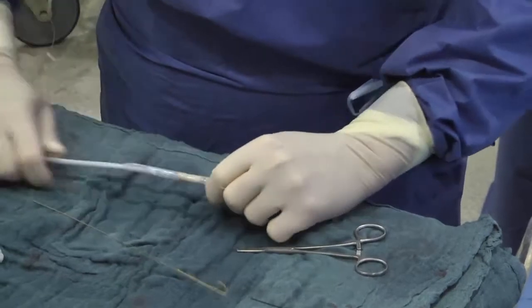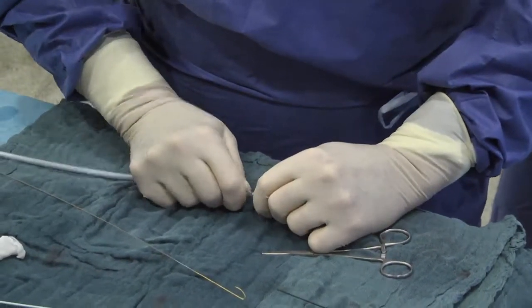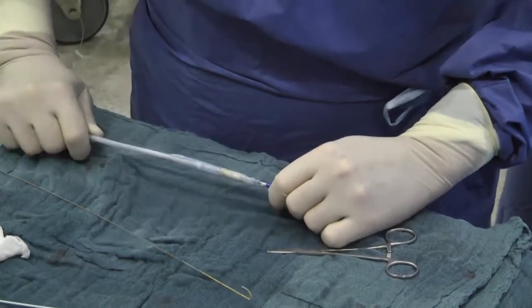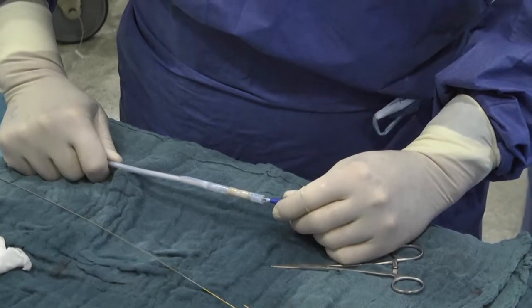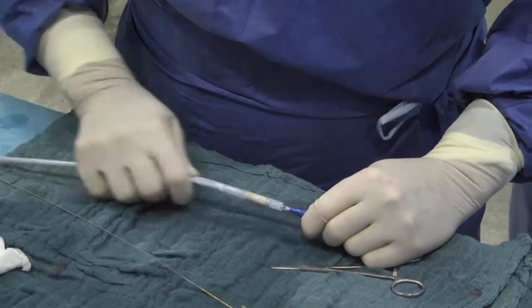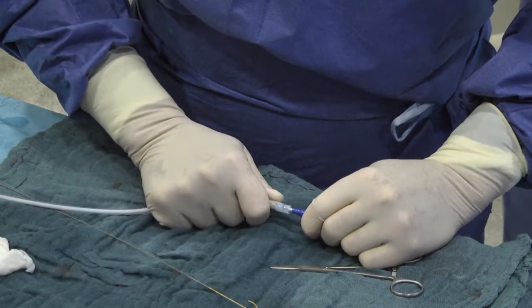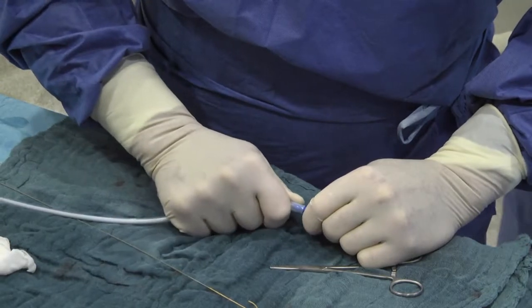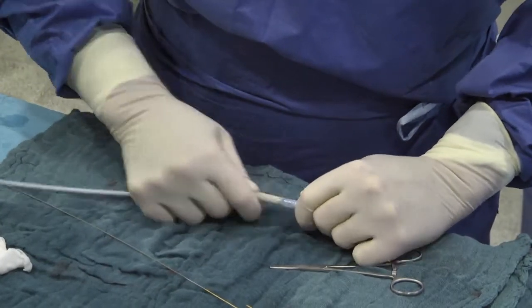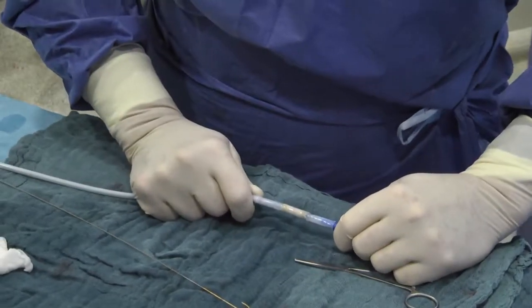Okay, there we go. This should work. Inflate the outer. Just have to immobilize a little bit the outer. Not too much. Deflate a little bit. Okay, we are in position. We're good. Great. Okay, good.